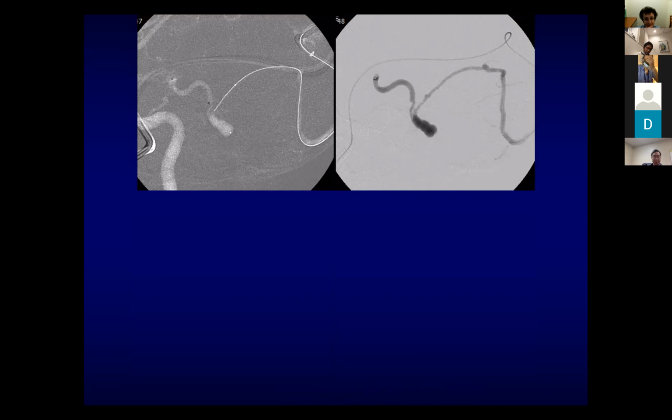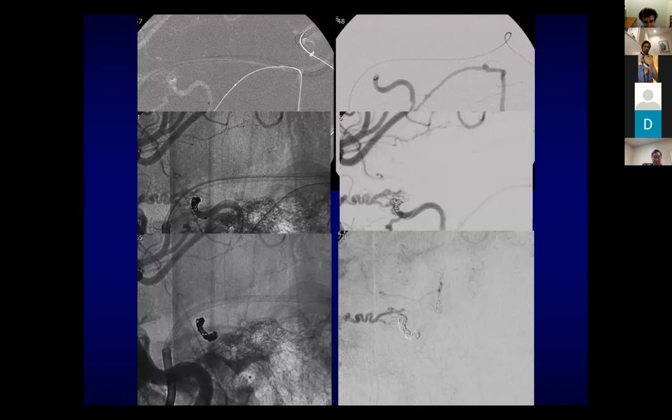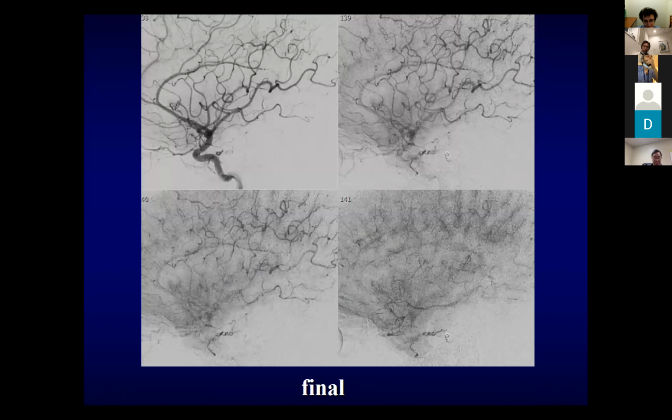It was not so easy to pass this venous dilatation, which probably was the source of the bleeding. But finally, he could get over there, and reaching the foot of the vein, he could place a few coils, 2 or 3 coils, not more, occluding the fistula.